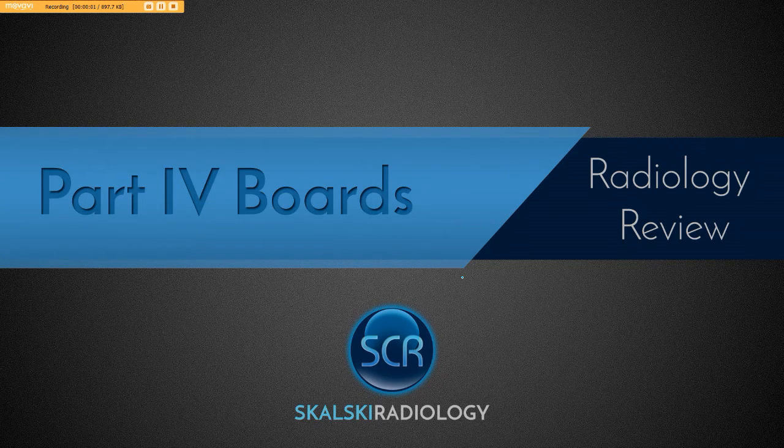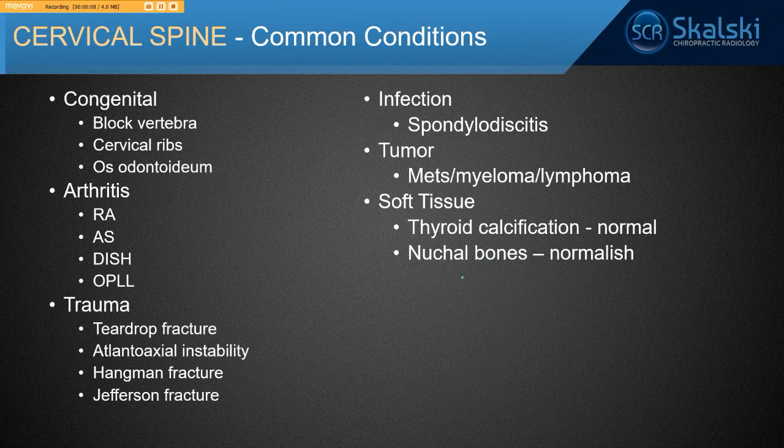All right, so I put together a quick Part 4 board review for you guys here. It's by no means supposed to be comprehensive or anything like that, but hopefully we'll hit the highlights, cover basically, hopefully all of the conditions you might see pop up on your Part 4 radiology exam. This is just kind of a summary of some of the most common cervical spine conditions, so this would be a good slide to go back to if you want to look stuff up.